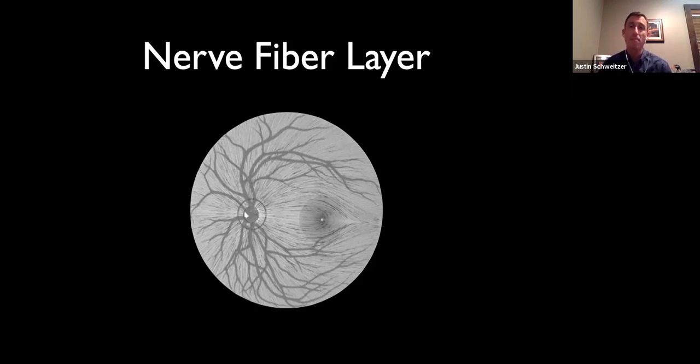The other thing to keep in mind, I'm going to show you a stat here in a little bit, is that not always do these things match up, and quite commonly they don't. The majority of the time, retinal nerve fiber layer thinning occurs before a visual field defect. And by definition, if there's a visual field defect present, we're already in the mild to even moderate range of glaucoma. So we do want to pick this up before a visual field defect most often.